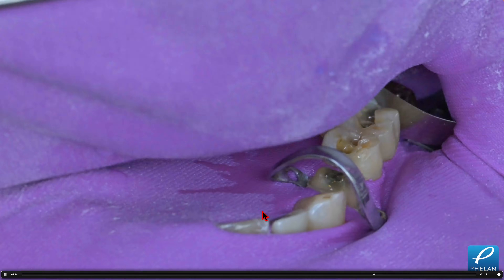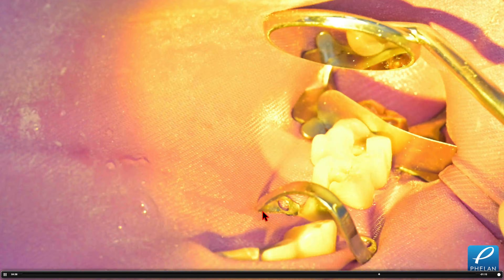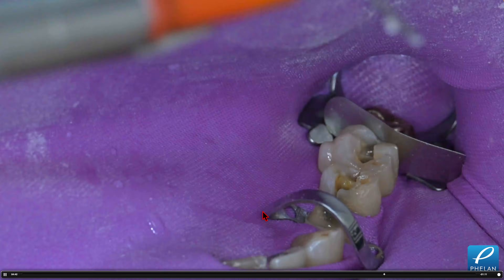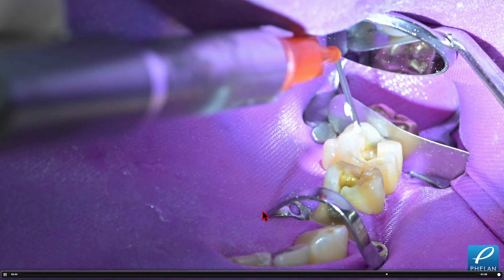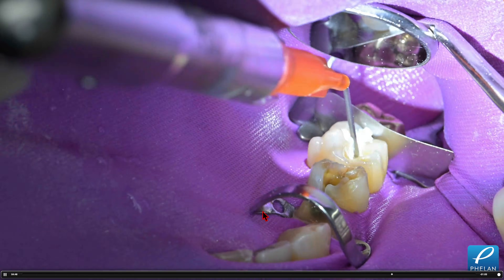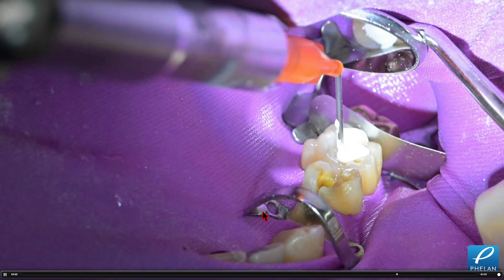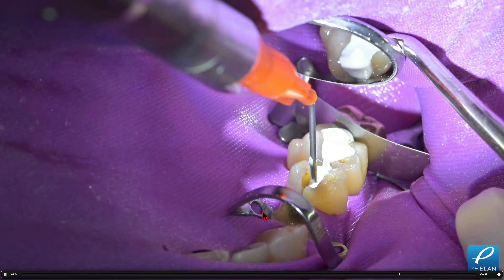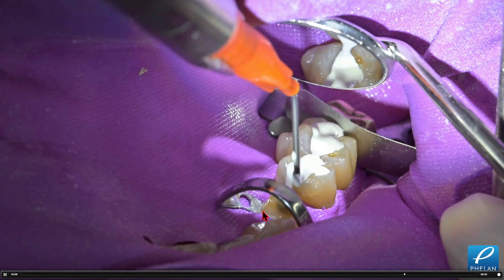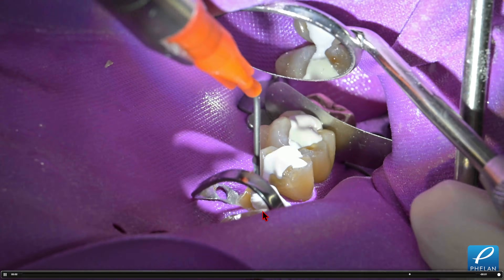Now injecting the core paste after adhesive. We're doing onlays and onlay veneers on the posterior teeth, but I'm doing a base with the core paste because they had deeper fillings. We could have used direct composite here, but we decided to use the base and core paste since I was having it out. And look at this premolar — the B4 clamp retracts perfectly.